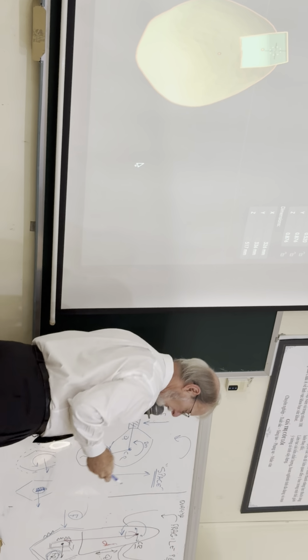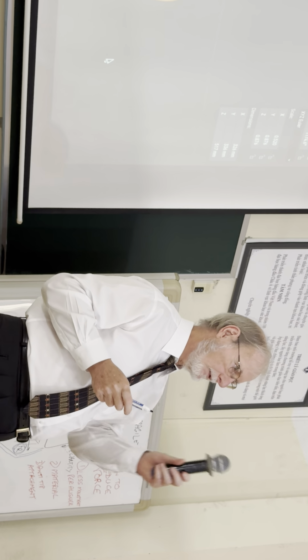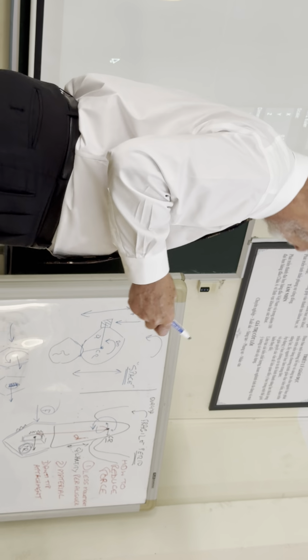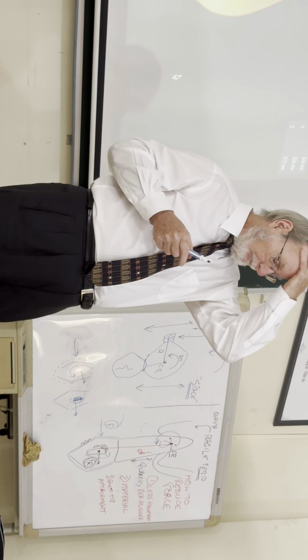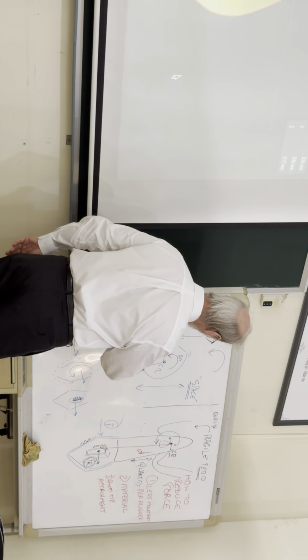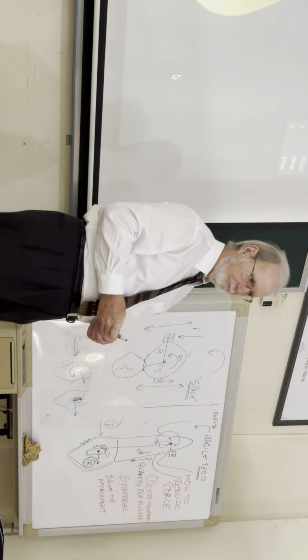The first thing you do when you rotate the tooth on the aligner is to create space. Don't listen to Invisalign. I've been fighting them for many years. They work, but the prediction is good on the computer, but it's not as precise. So you better compensate for the imprecision, like I said, by making more space. So you have more space here, more space there. And what you do is you put a force here, and what happens? Put a small attachment there. And I put the same force on the other side. What happens? What's the difference?